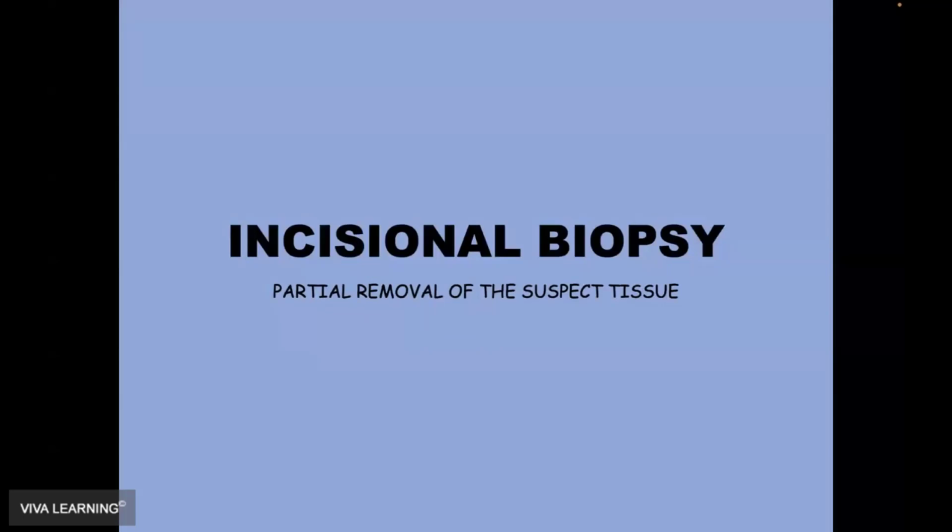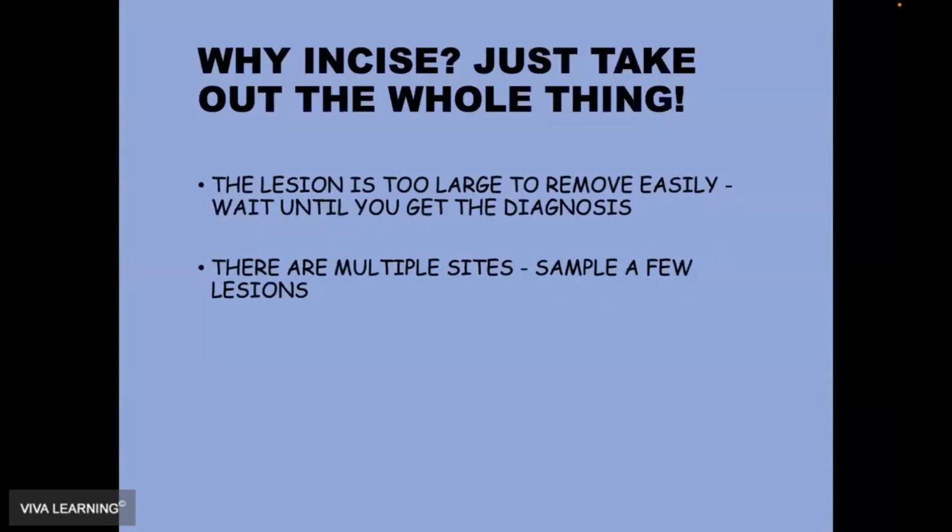Incisional biopsy is we remove only part of the suspect tissue. We don't remove the entire thing. Why would we do incisional rather than excisional? So let's discuss that. Number one, the lesion may be too large to remove easily, so wait until you get the diagnosis. Because if you biopsy little pieces of a large lesion and it turns out it's benign, you may not need to remove it. Patient may be able to live with it. Or there are multiple sites. So you sample a few sites, a few different lesions before you remove the entire thing.